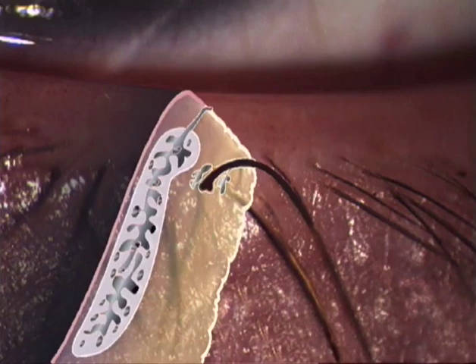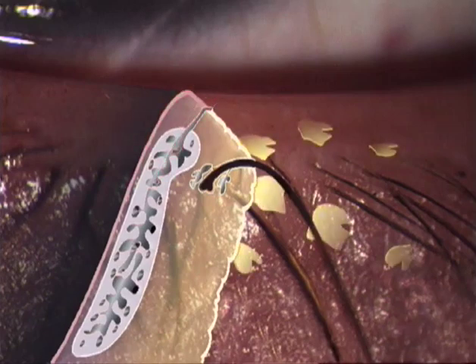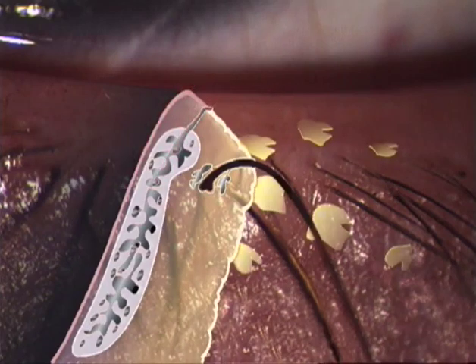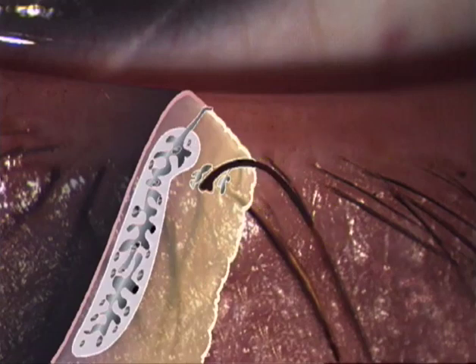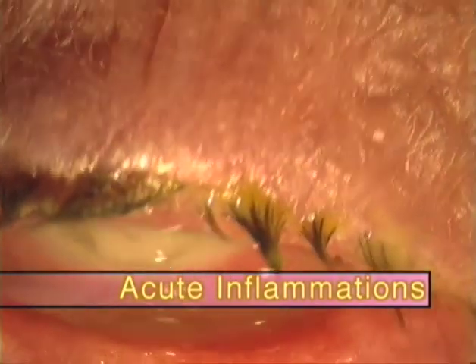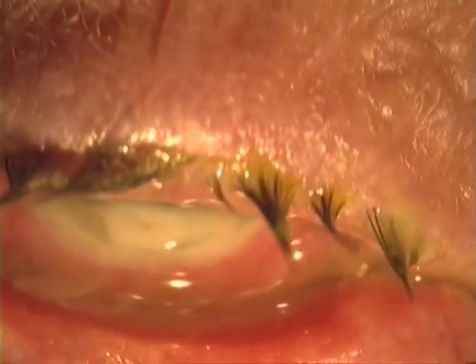In such a case, the site of origin of the secretions may be the conjunctiva, the tarsal glands, or a generalized skin disease. While the search for the source of the secretions is easy in case of a highly active acute disease, it may become difficult in case of low activity at the site of origin. In acute inflammations, usually the material of the secretions is purulent. For example, here the source is a purulent infection of the conjunctiva and cornea, and the origin from the conjunctival sac is evident.